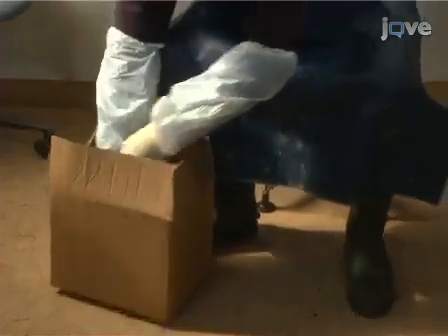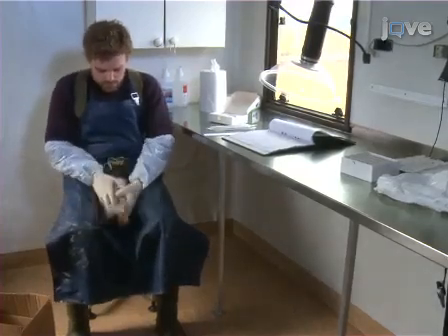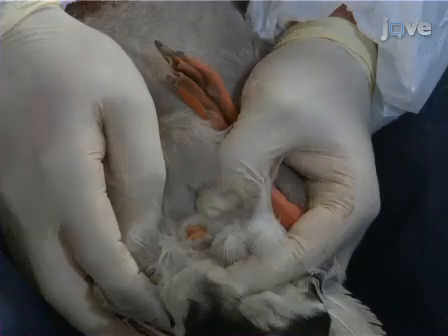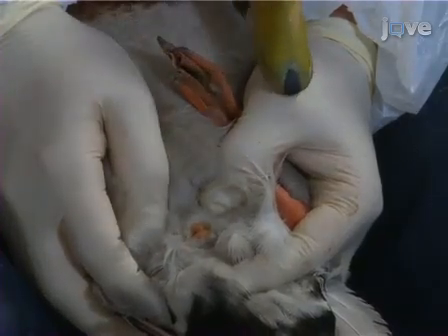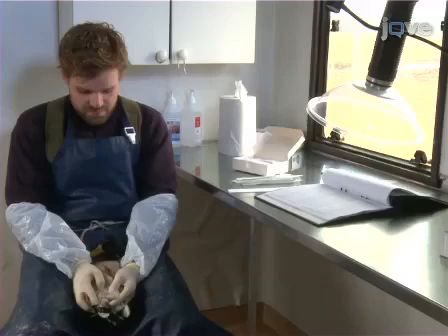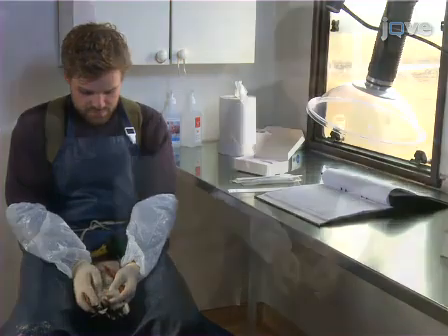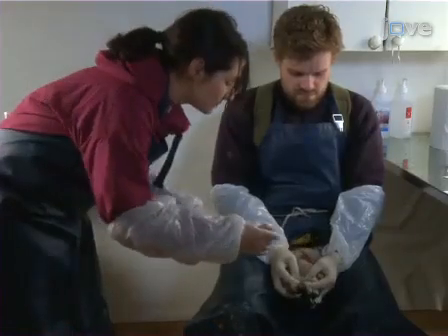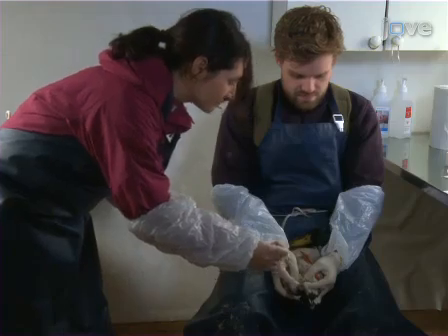If droppings are not present at the bottom of the box, perform cloacal swabbing by first turning the duck on its back to permit access to the cloaca. The cloaca is a protruding structure situated below the abdomen, close to the base of the tail. An experienced person can hold and sample the bird at the same time. If needed, a second person can assist, taking the sample while the first person holds the bird.